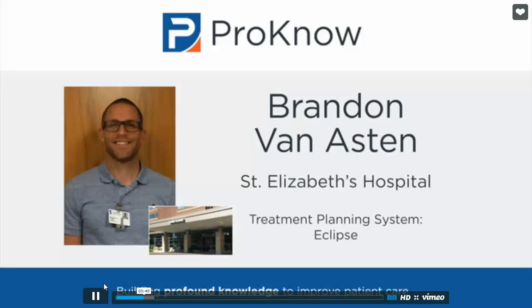Was there anything special you needed to do to get the data set into your treatment planning system? Did you go through MIM or another third-party software? Yep, so we do all of our contouring, our fusions, all kind of our elaborate composite doses. We do all that in MIM. So we brought the data set into MIM and just made some planning contours on there and then sent it over to Eclipse.